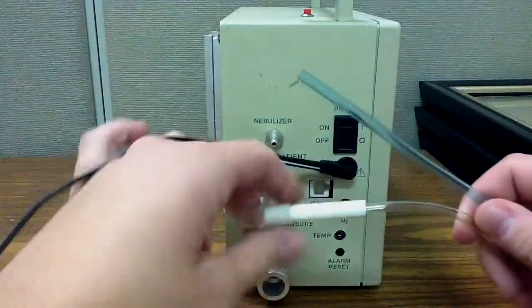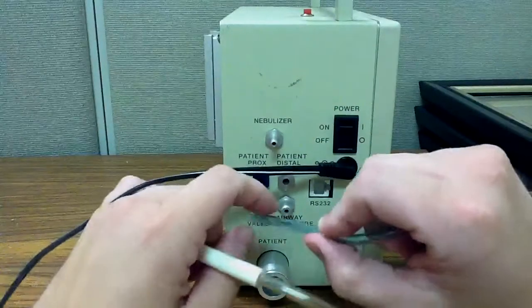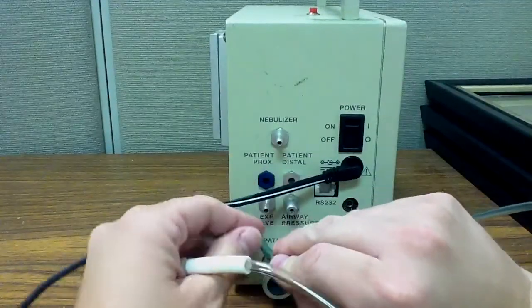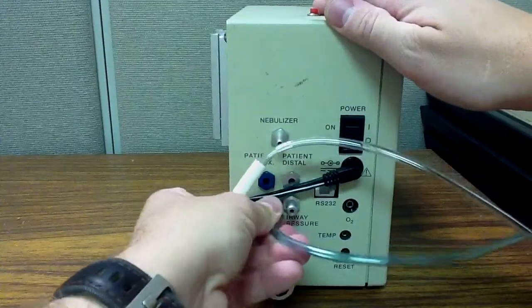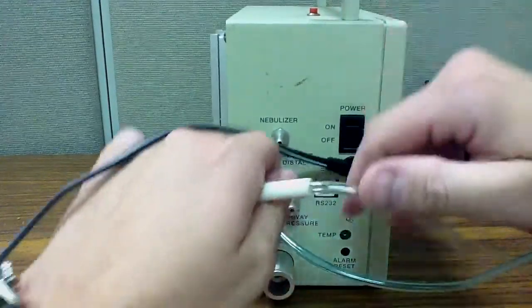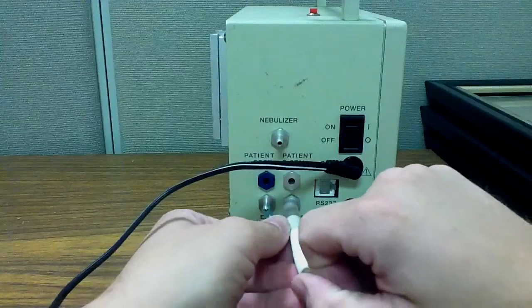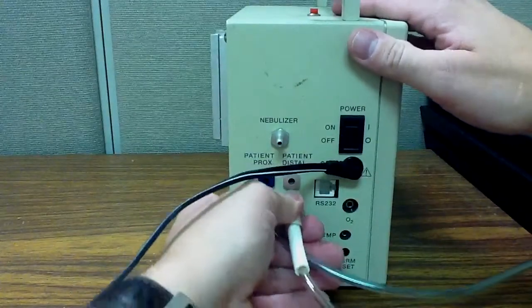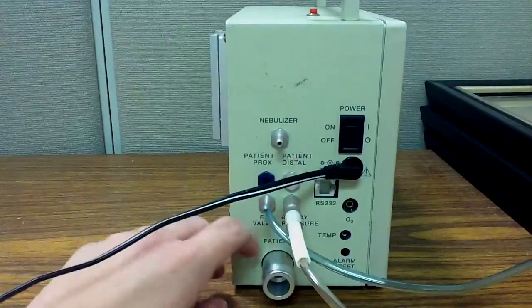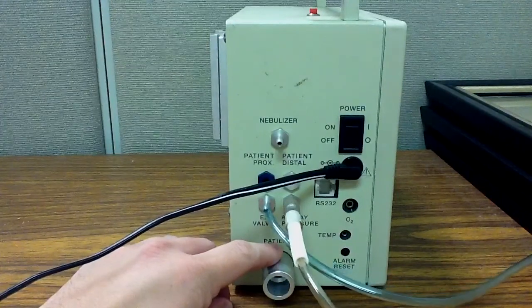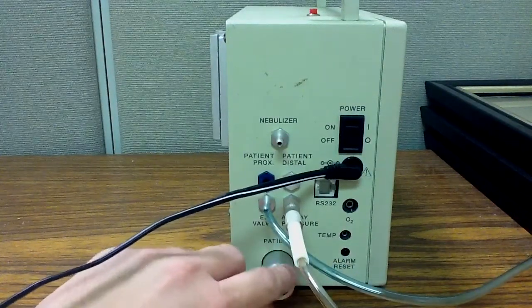So these lines here. My exhalation valve line will simply slide right in. My airway pressure monitoring transducing line will slide in like that. And then the ventilator circuit itself will plug in here.